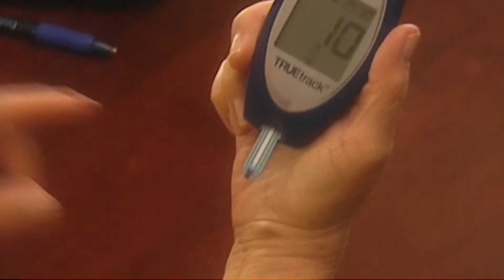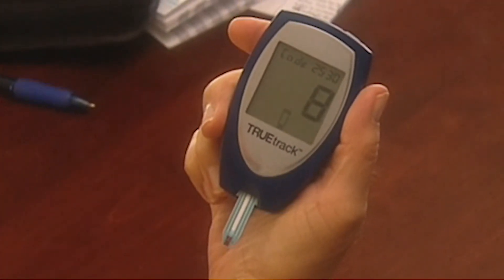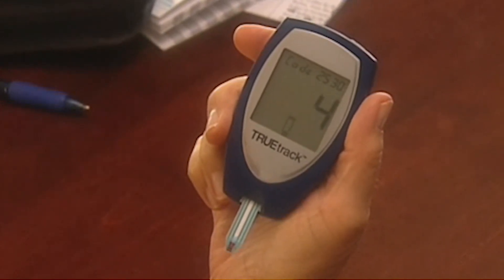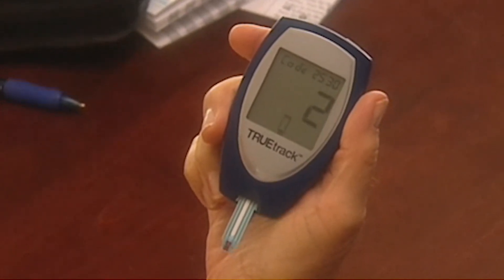The meter will begin to count down from 10 seconds to zero. Be sure to apply the blood sample to the tip of the test strip and not to the top of the test strip.